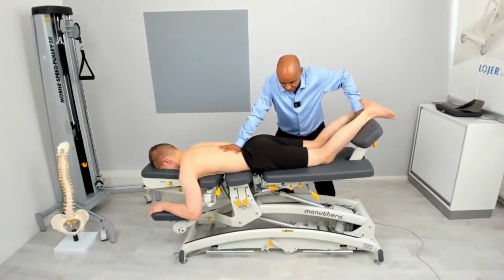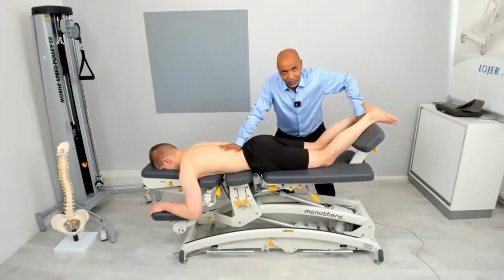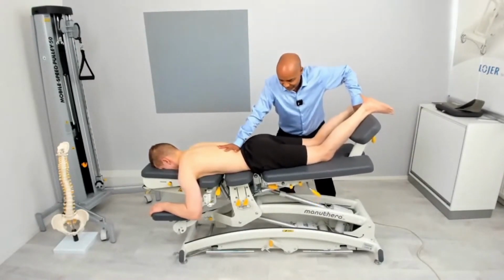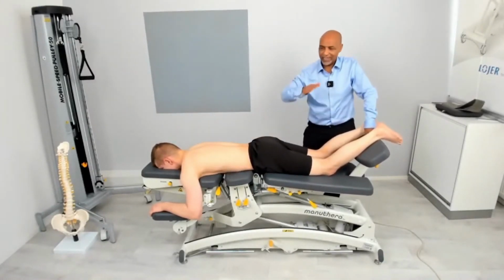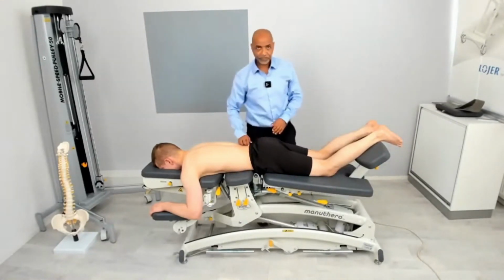This helps to restore that, because when the patient is standing, when you tell them to stand upright, it's going to be painful. But when you add this extension and pump it, and then again increase the extension, this will help them to get back upright. In that case, we know that the range of muscles and movement is correct.